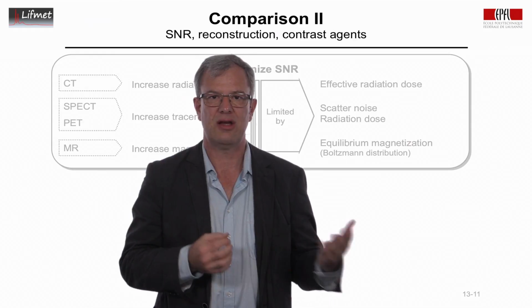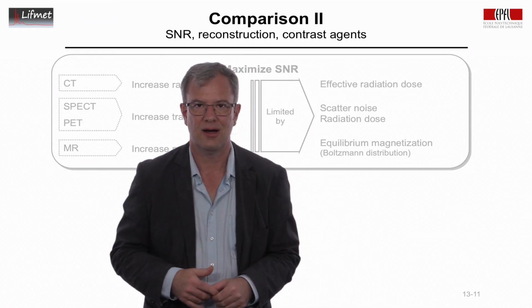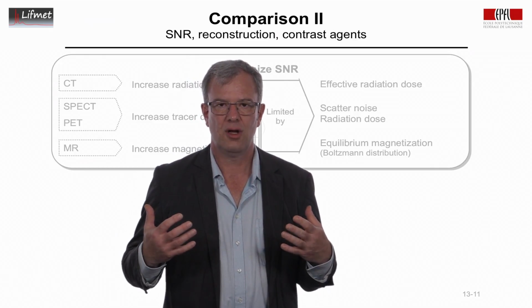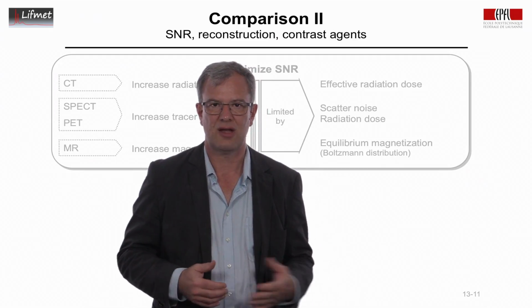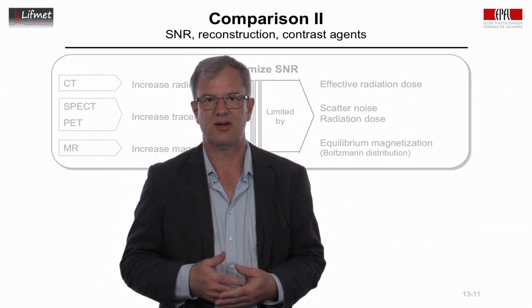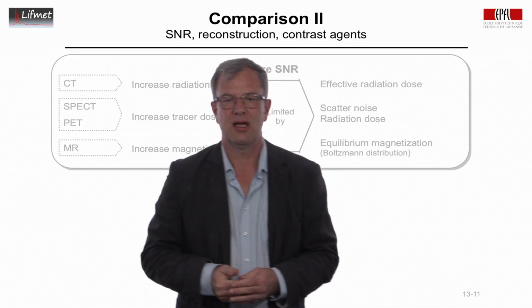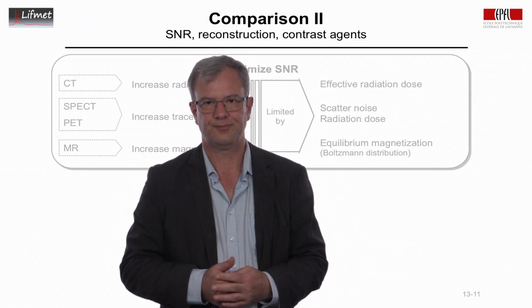If you include the radiochemistry unit that produces the isotopes on site, then you have to think of a cyclotron that you have to buy and maintain, and a team of radiochemists that makes the cost then different. If you can buy it from elsewhere, then the scanner itself is a bit more expensive than the SPECT scanner. And finally, MRIs are the most expensive instruments to buy.